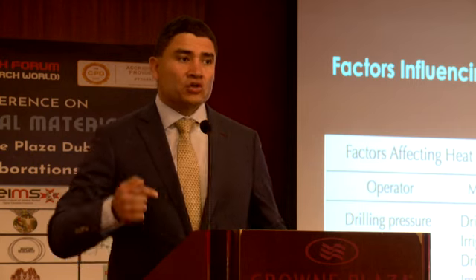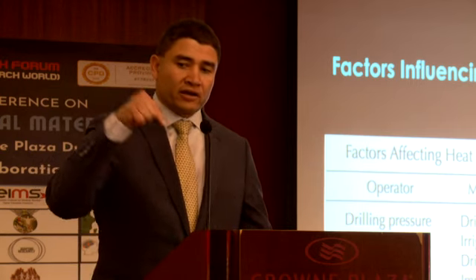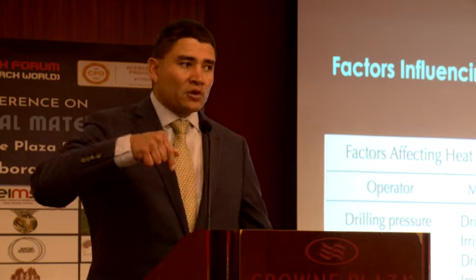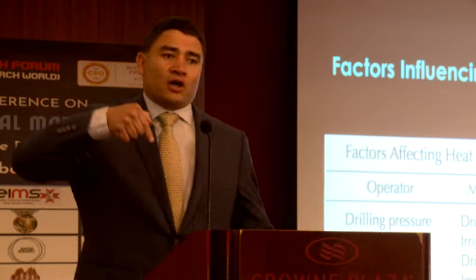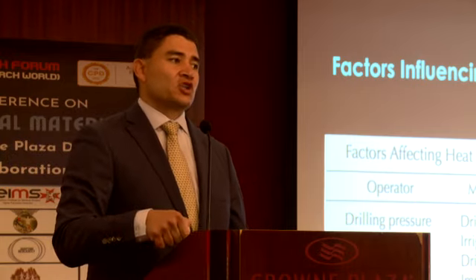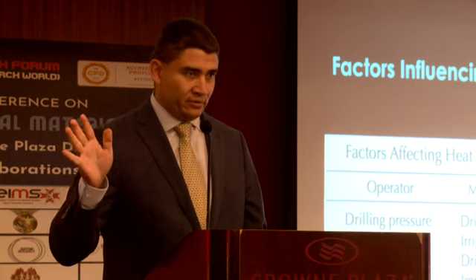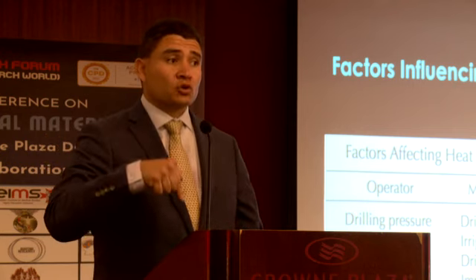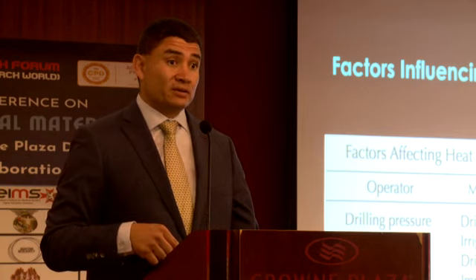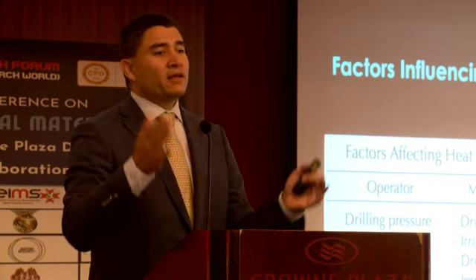And the drilling time. How many times are we drilling and we realize that we cannot penetrate the cortex? And we're sitting in there until it finally gives up, boom. Okay, we are in the cancellous bone, great. You smell it burn, but it doesn't matter, right? We penetrate the cortex, but we spend enough time trying to penetrate that cortex, right? How many times? Every one of you that places implants has gone through this problem, yes or no?